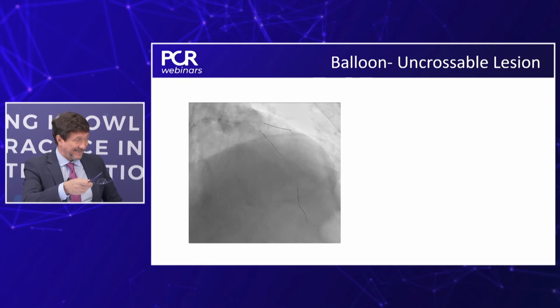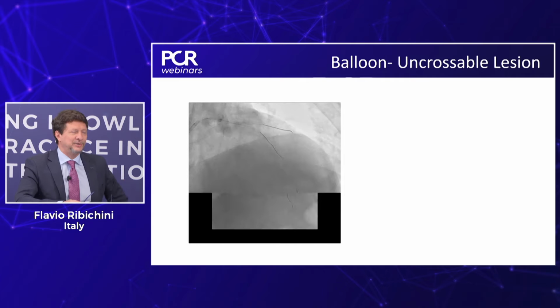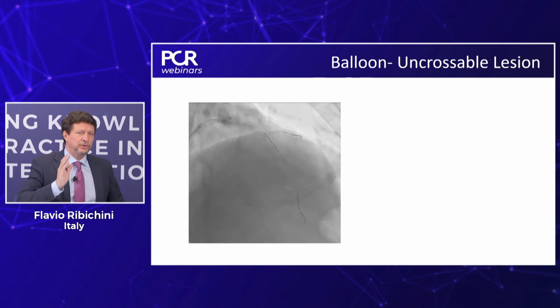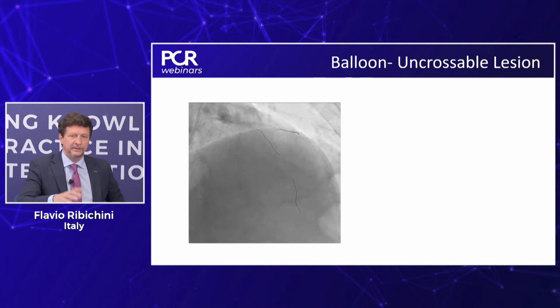Well, here it's curious because your IVUS probe did cross. So as we said, there is not a very tight spot, but the balloon 2.5 did not. So it's an intermediate difficulty. The first question I asked was very provocative. Would you go with direct stenting? Well, you said very gently, I wouldn't. I'd say never. You should never go with direct stenting when you see calcium in the angiographic image. This is the first recommendation we have in the European consensus document related to calcified lesions.